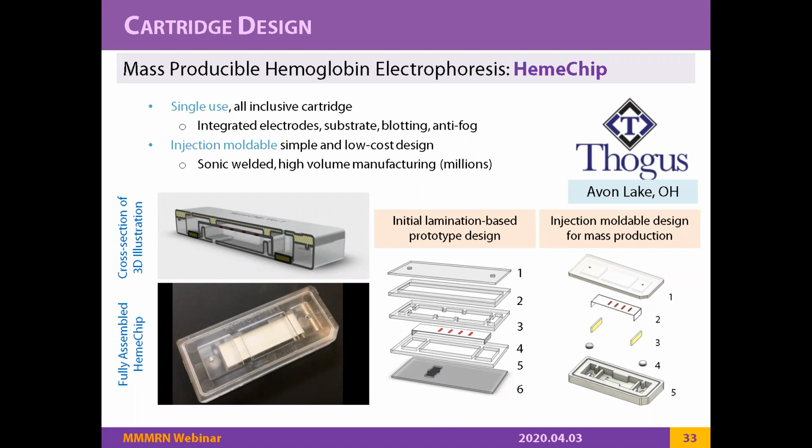But if you look at the application, we don't apply any strain on the assembly that could make the seal inactive or start to peel off, right? We don't apply any pressure, we don't apply any tension. So once it's sealed, it remains pretty much airtight and watertight. When I'm saying airtight, I'm talking about the joints, not the hole that we have above. So that worked pretty well, but the process is really, really time consuming and laborious.